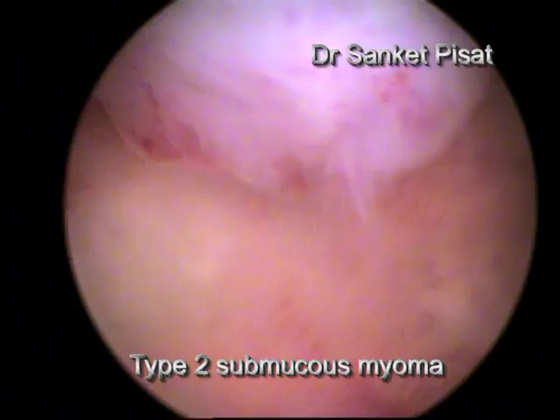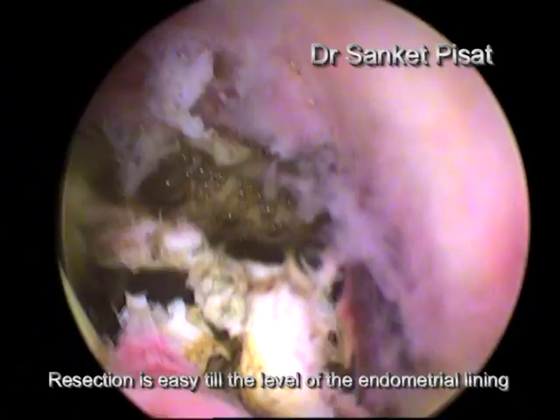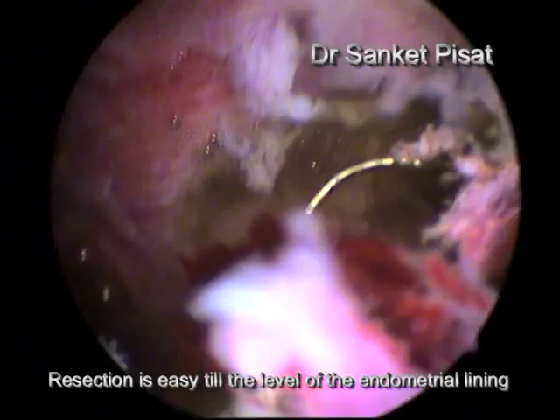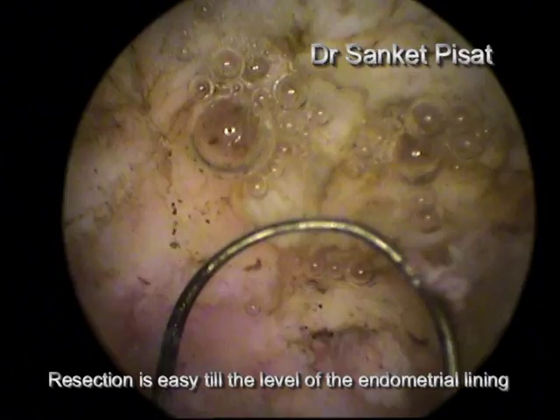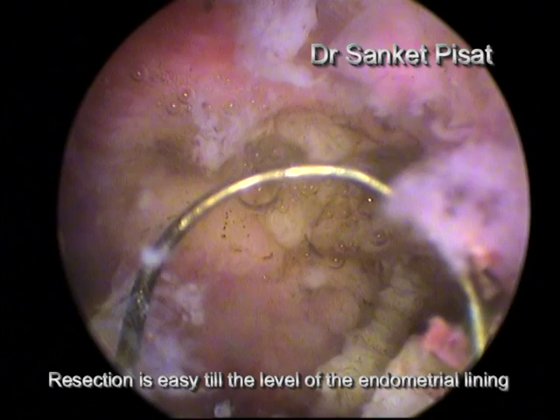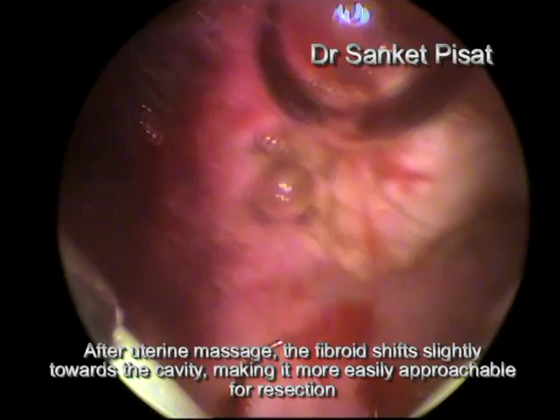Resection is started and is easily continued up till the level of the endometrial lining. However, at the endometrial lining where the fibroid is flushed to the endometrial lining, the surgeon is faced with the dilemma of either cutting into the myometrium to scrape out the fibroid, thereby increasing the risk of perforation, versus leaving a part of the fibroid behind. It is at this stage that the hysteroscope is removed and a vigorous bimanual massage is given, causing the myometrium to contract and push the fibroid into the cavity.